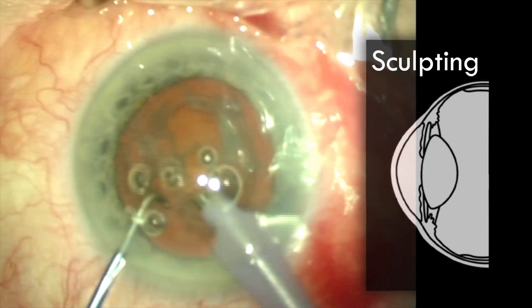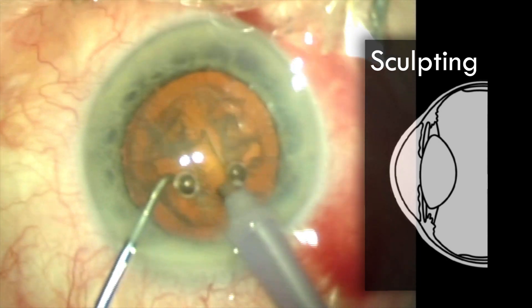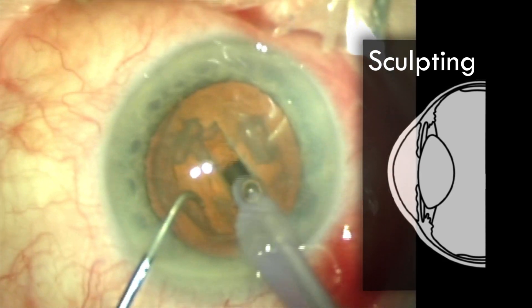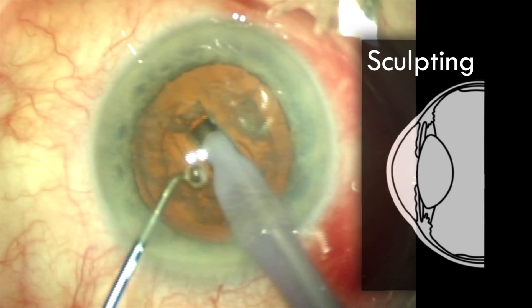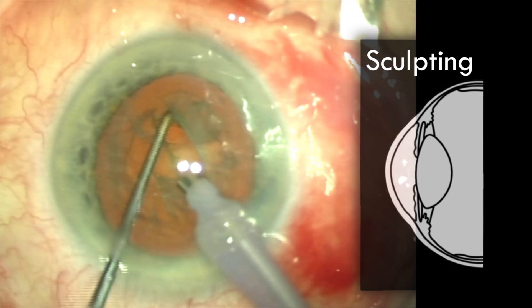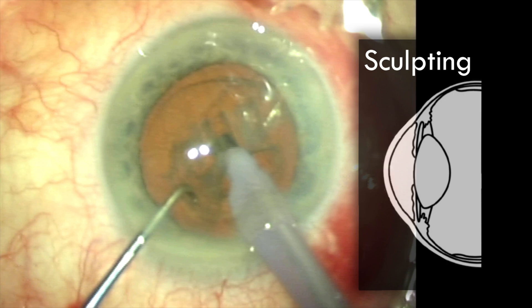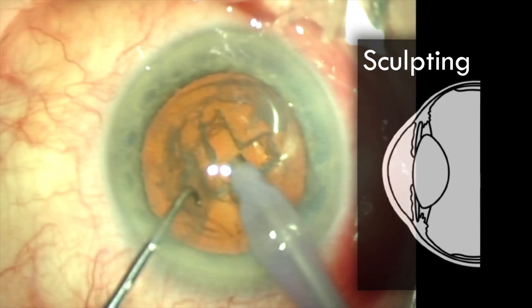I start by sculpting two perpendicular grooves, being very careful with my depth and aiming for about three millimetres depth centrally. I don't want to touch or damage the posterior capsule, as this is a very important structure in supporting my lens implant. There are many different techniques that can be used to remove a cataract. I'm using a technique called divide and conquer here, which means that I divide the cataract up into four quadrants and then remove them individually.